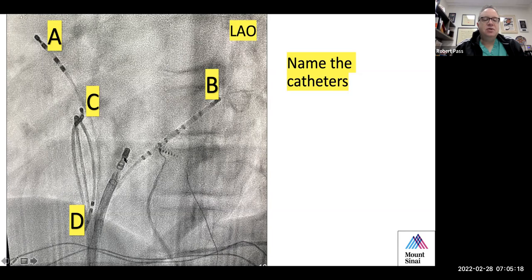So this could be an ablation that we're looking at for a pathway located near the posterior septal region, or this might be Dr. Love adjusting the catheter to do a slow pathway modification in the lowest third of Koch's triangle, which is in this general vicinity here. But very good. In a lot of labs, they're not even using fluoro at all anymore, but you can see this exact same projection on Carto as well. So, okay.